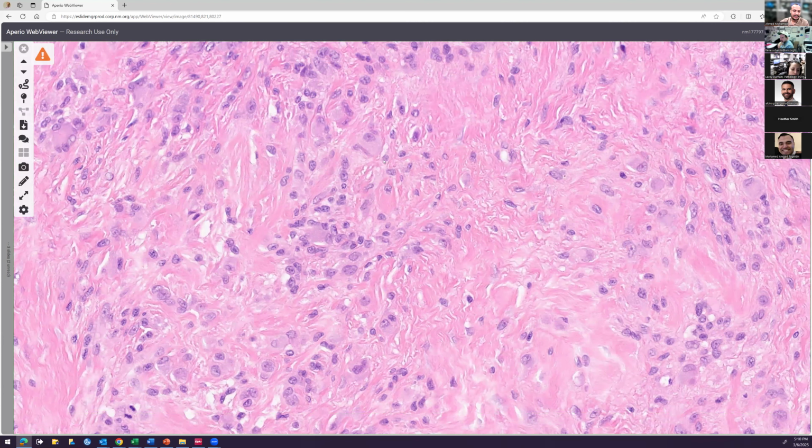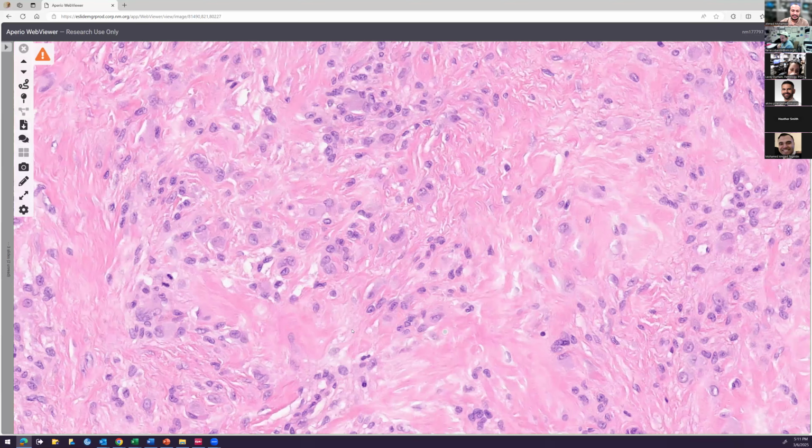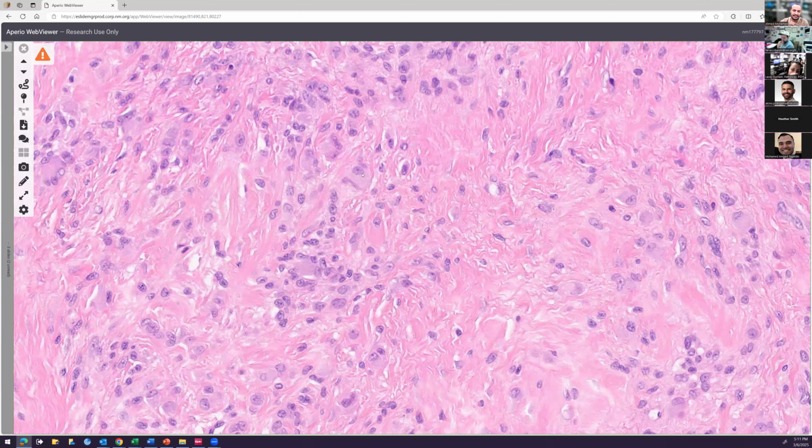Are these reniform? They look kind of crunched. There's a few, right? But think back to what we just talked about with the concept of histiocytes. They have a lot of different looks, so this is in essence histiocytoid morphology. Abundant eosinophilic cytoplasm, and exactly what Lacey's talking about, you have misshapen contours and a very delicate chromatin pattern, very typical of histiocytes or histiocytic lineage type cells.